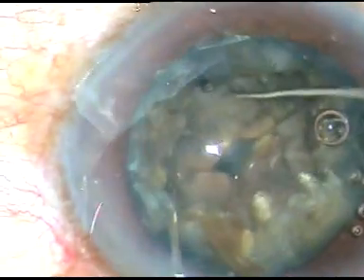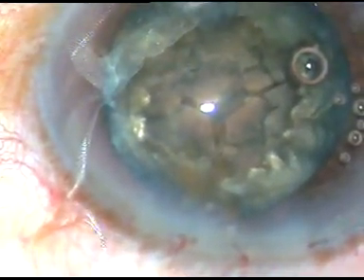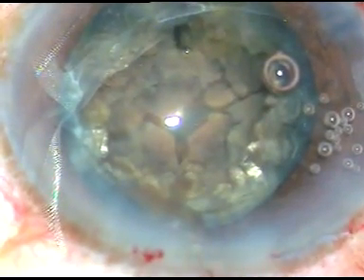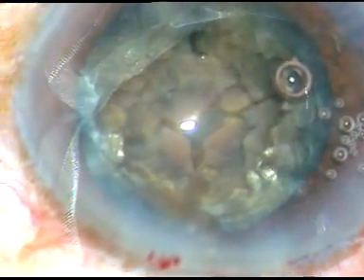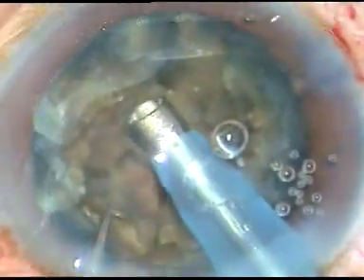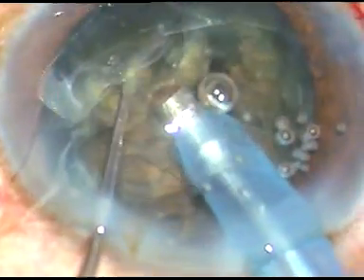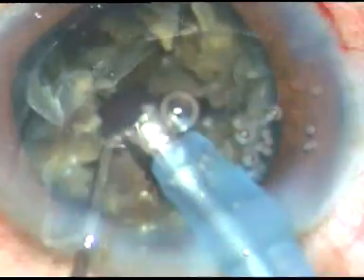Now I inject viscoelastic again and the tip of the phaco handpiece is introduced. In phaco 2 mode I start emulsifying the fragments — phaco power 85%, flow rate 45 ml per minute, vacuum 450 mmHg. With high power, the pieces are being emulsified easily and are coming out easily.